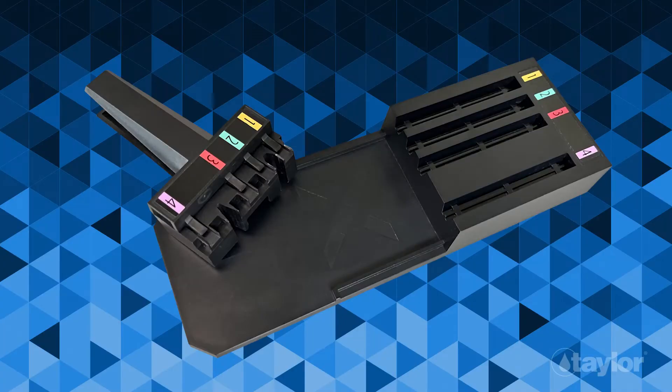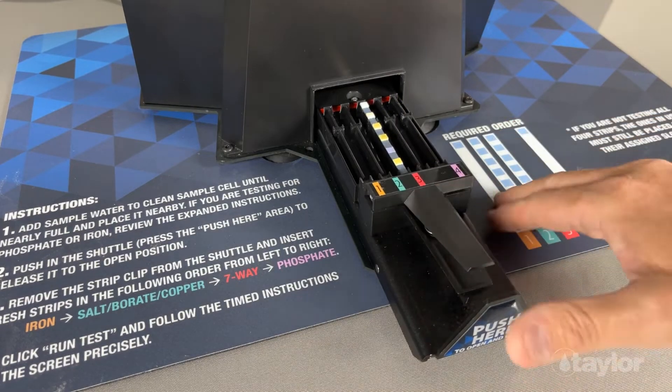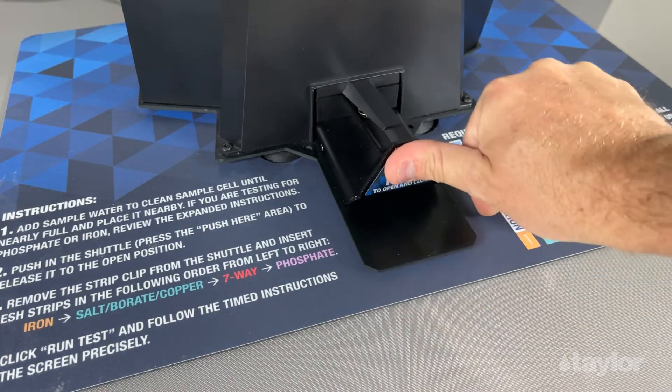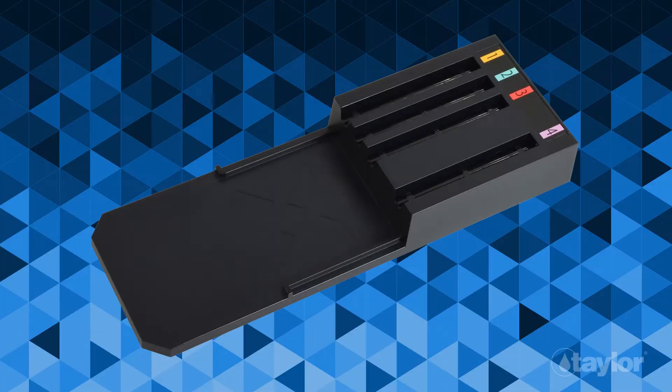The strip clip and strip loader are color-coded and labeled to match the corresponding test strip to ensure they are read properly by the device. You have the flexibility to run any combination of test strips depending on the results you are looking for. But for this demonstration, we will be running all four strips. The strip loader makes adding strips simple, and it ensures the strips are aligned for accuracy.